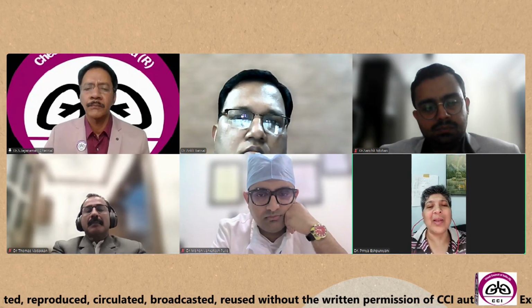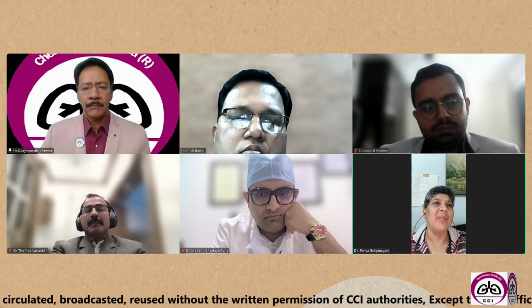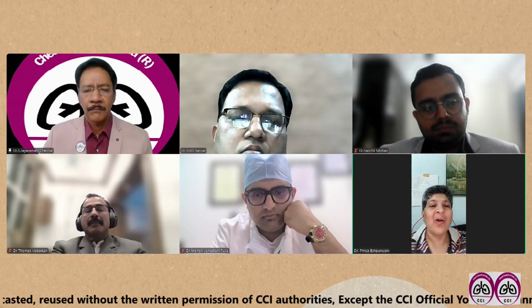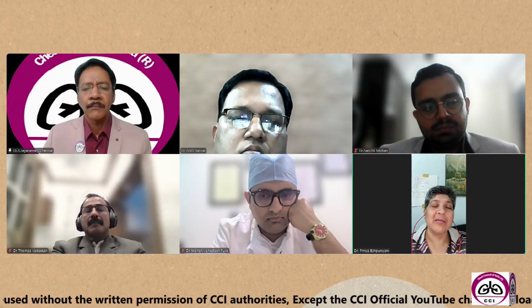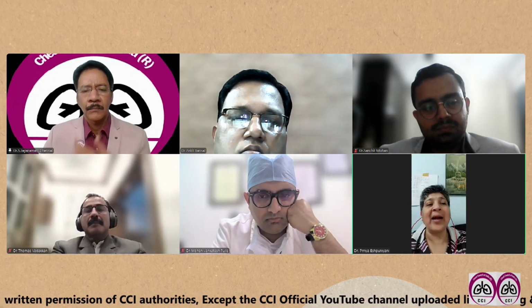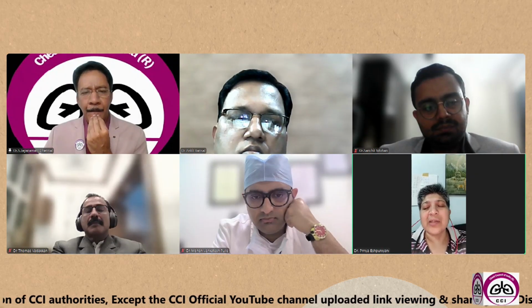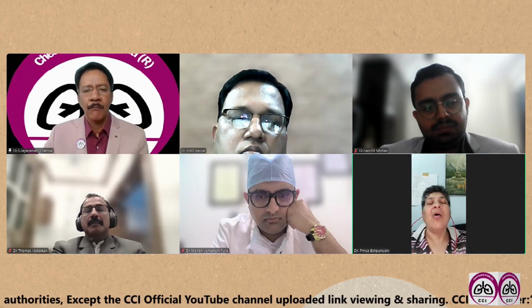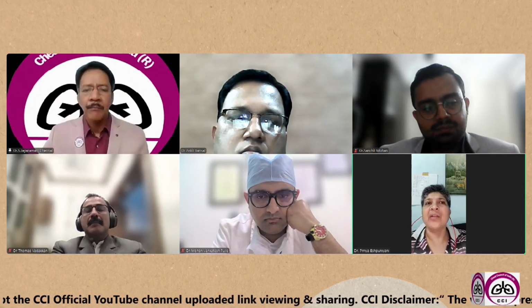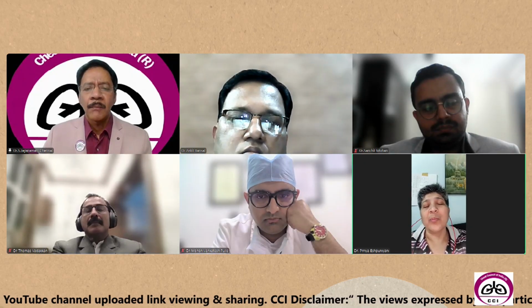Now, normally all of us will be stuck, because that is actually an opposite side mediastinal lymph node, single station. Should I consider it N3 or not? And if he has a history of tuberculosis in the past, I actually had a similar kind of patient. Then a mediastinoscopy in the form of VAMLA, or an EUS, a good EUS by a good person, will have a very significant role to play, sir. So these are my two bits.